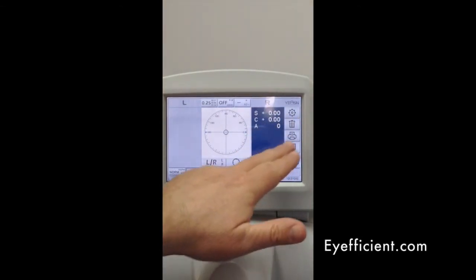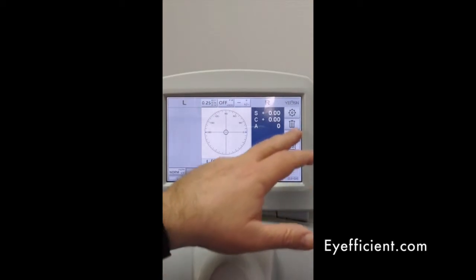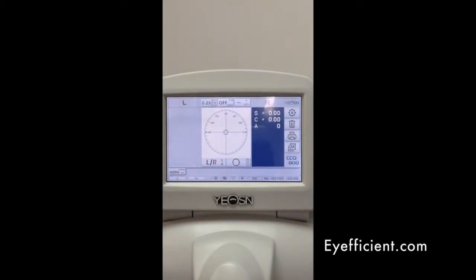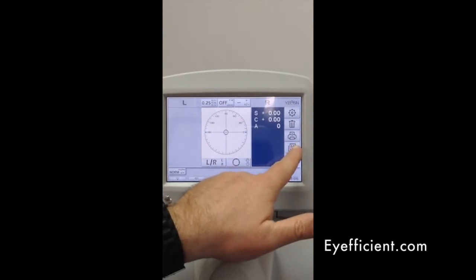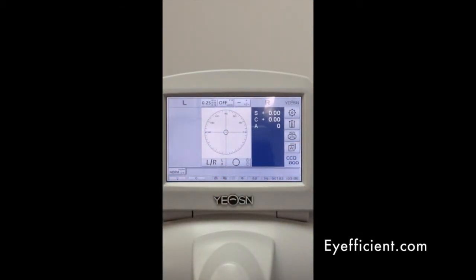You have tabs along the right that allow you to delete a previous measurement if you haven't printed or cleared it already. You can hit print to print out on the tape, or you can also export to EMR. You have a button to switch between automatic and manual capture mode, and there's also a button on the front of the instrument near where the glasses rest that you can press in manual mode to take a reading.